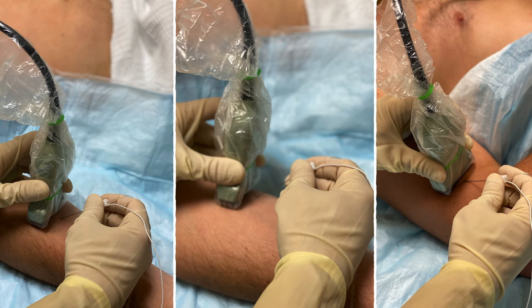These blocks are easy to do using an out-of-plane approach as well. Just be sure to bring the needle down on the side of the nerve and not to contact it directly.